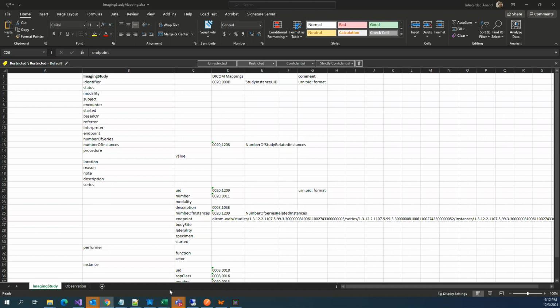And I'm asking in terms of security. Yeah, security is a little tedious actually. As I said, currently what other applications generally do is they do it outside.